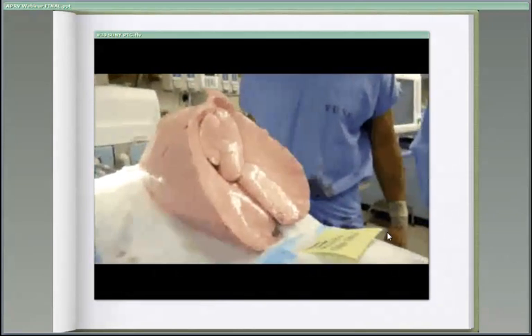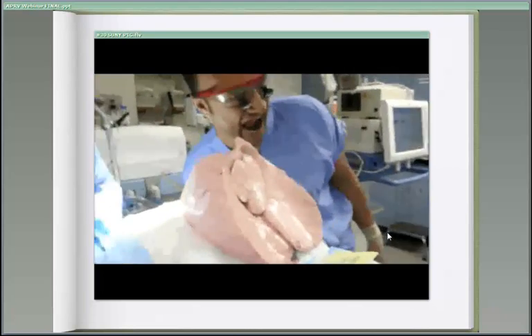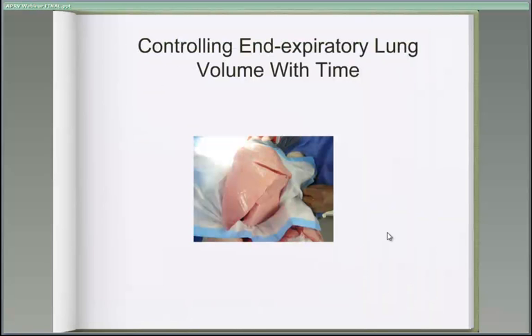In fact, if you look at the mean airway pressure as an indicator of mean alveolar volume, you'll see that APRV is one of the few modes where the peak airway pressure and mean airway pressure are almost identical. And so the stress strain, which may be important, if I were to summarize a lot of ventilator-induced lung injury, one of the things that seems to be very important is high amplitude ventilation. That's why high inspiratory pressures, sometimes generated by tidal volume, and low PEEP can generate a lot of lung injury. In fact, that's probably the most efficient way to injure animal lungs in the lab.